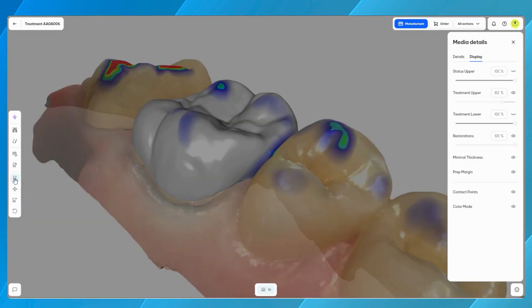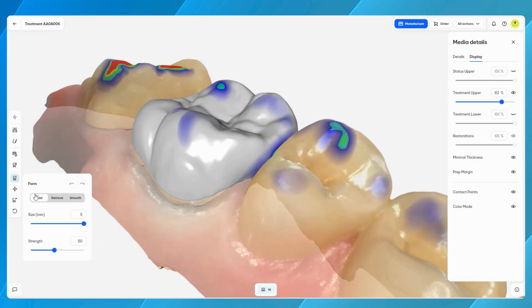The form tool enables the addition or removal of material, as well as the smoothing of specific areas. Each function within the tool allows customization of two key parameters: the diameter of the affected area and the intensity of the effect.